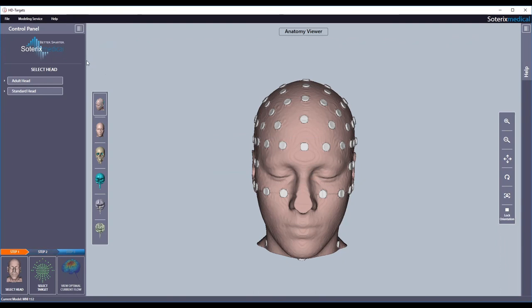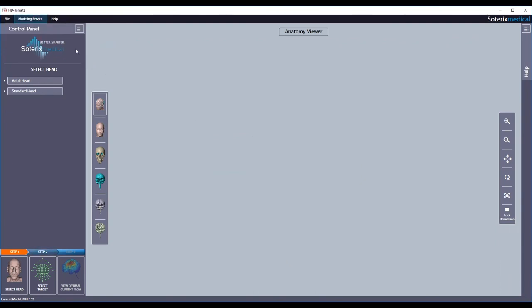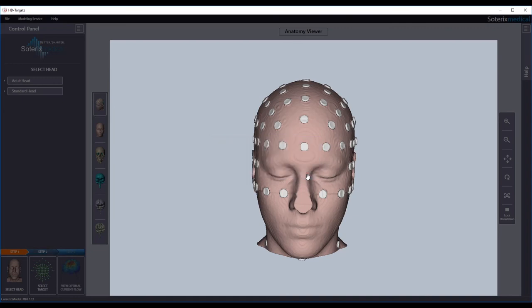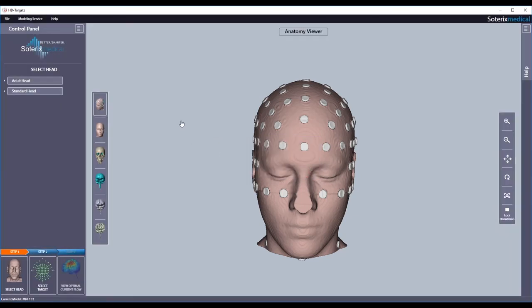Once the solutions are available, you click the download head models option to download them to your local machine. The new head model will now be available for you to select in step 1 or in the select head step.